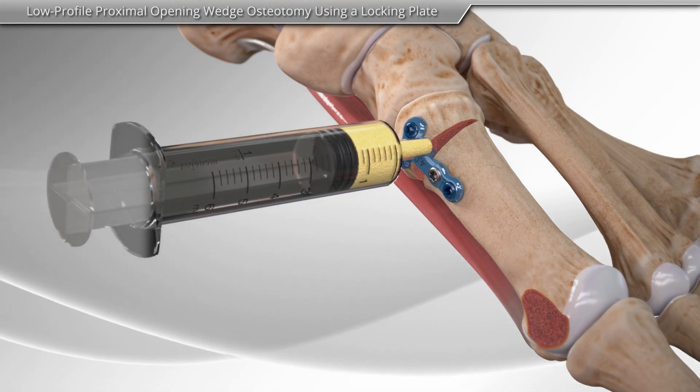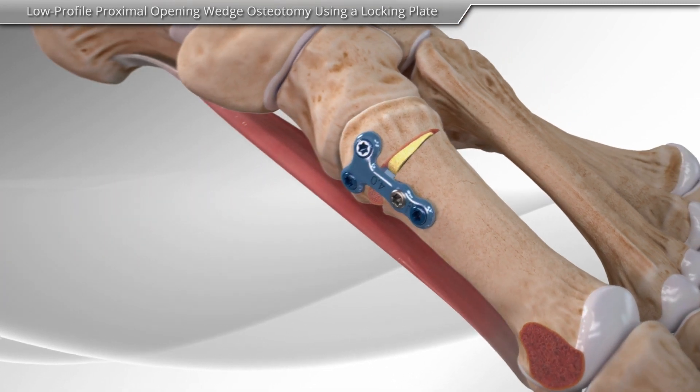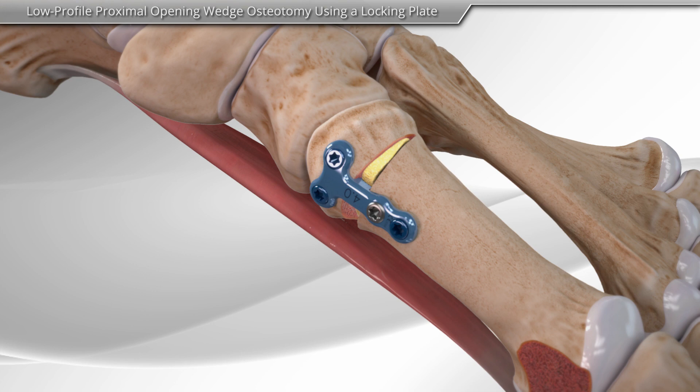Finally, your surgeon may choose to use a bone graft to help with bone healing. This completes the proximal opening wedge osteotomy procedure.